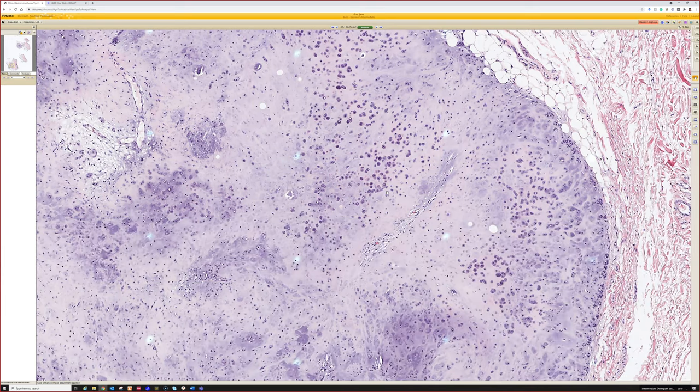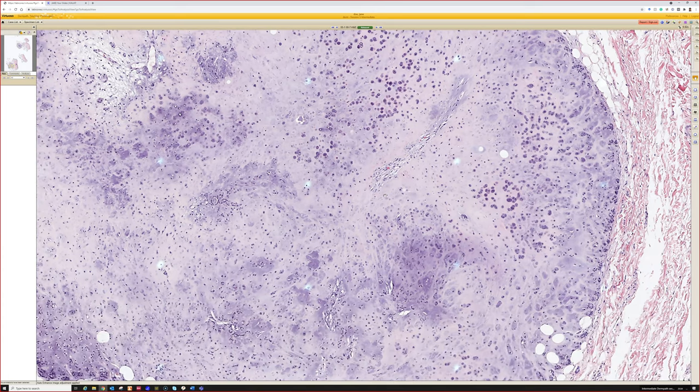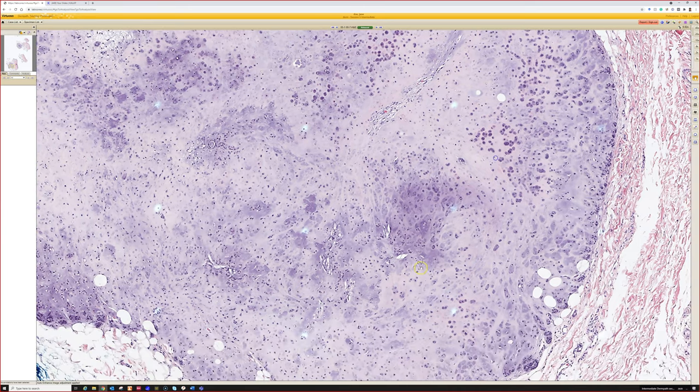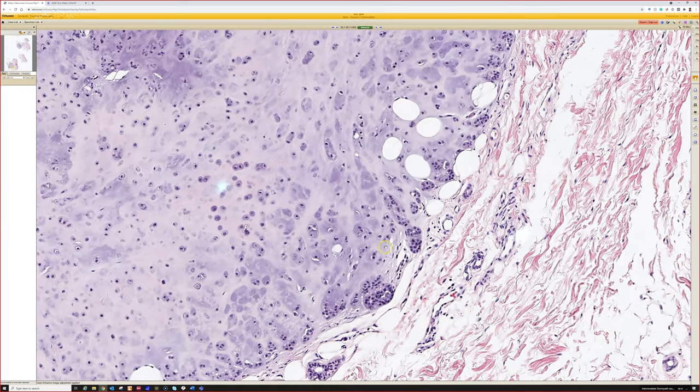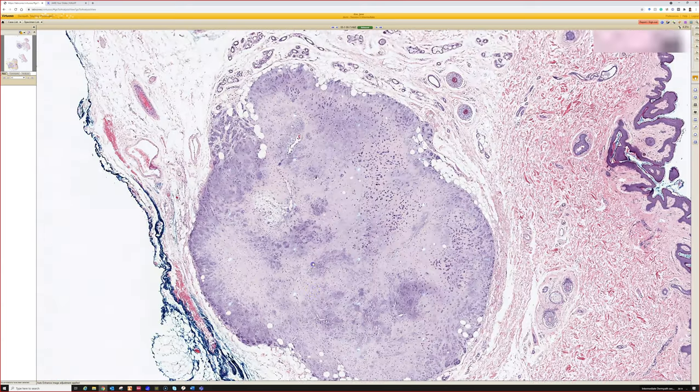And an important take-home is that myoepithelial cells will co-express keratin and S100. So that's why I've seen a case where you had big rhabdoid-looking myoepithelial cells and they were S100 positive and it got called a melanoma, incorrectly, unfortunately. It was a long, long time ago, but it was a very good learning case that I saw in training. So that's a good example of a mixed tumor that's very chondroid and has very small, subtle tubules.